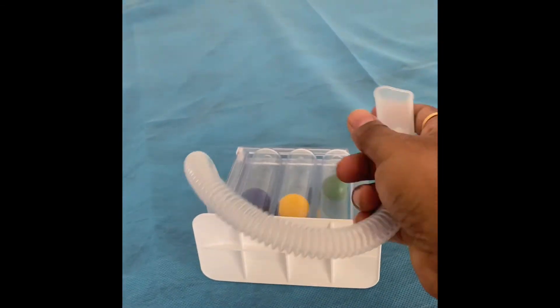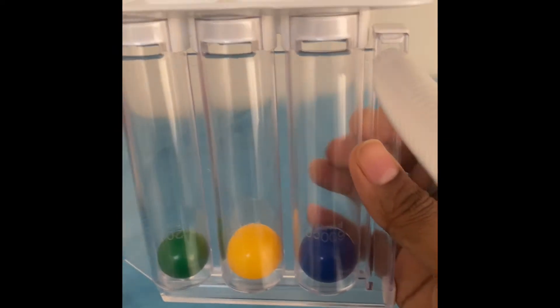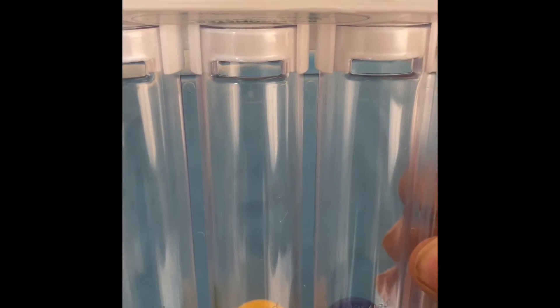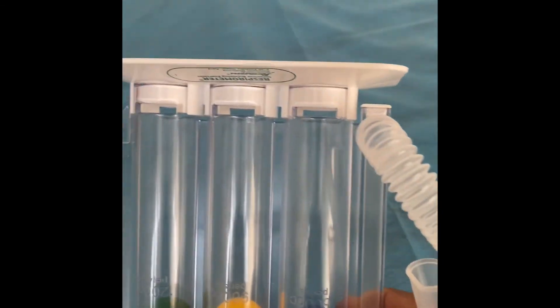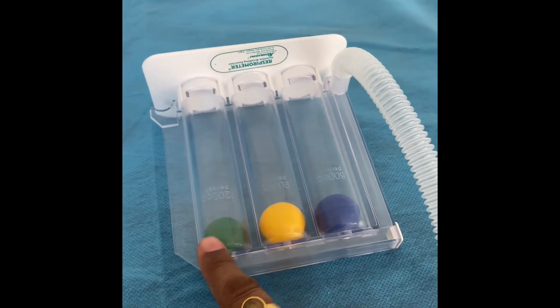Now what you have to do is put it upside down and blow it, so that all three balls touch the surface. As you can see, I cannot blow all three balls — not even the second ball. So my lungs are still improving. The first ball I can do, the second one went to the middle, and the third one did not raise at all.